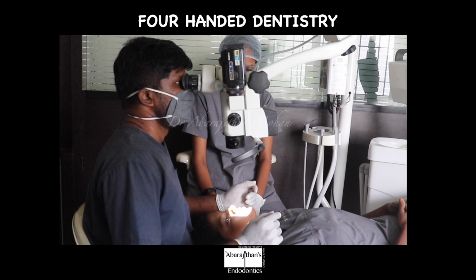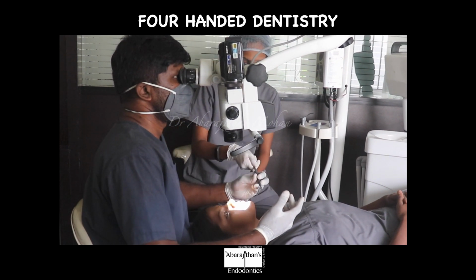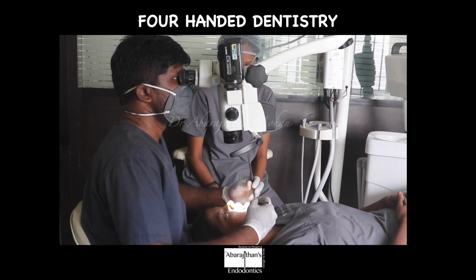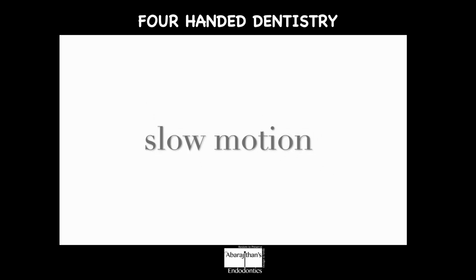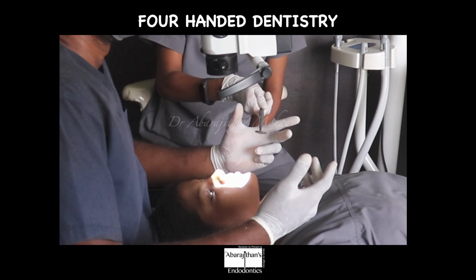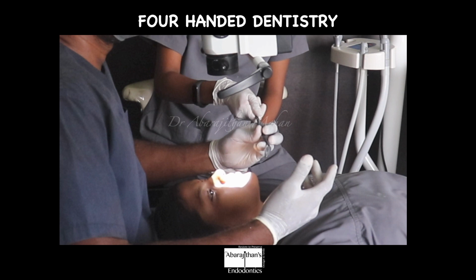So you can see a small demonstration here. I'm just spreading my fingers and my assistant is placing the mouth mirror in the left hand in such a way that I can immediately grasp it and start working. And in my right hand she has given a straight probe here, but during workflow she'll be handling different instruments in such a way that I just grasp it by the shaft and start working.